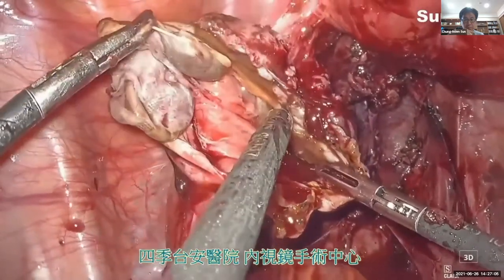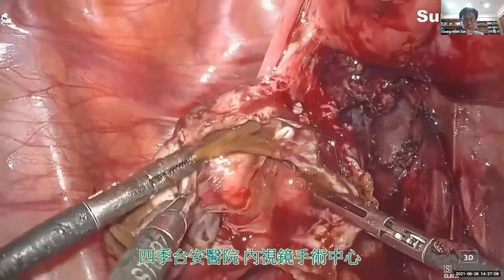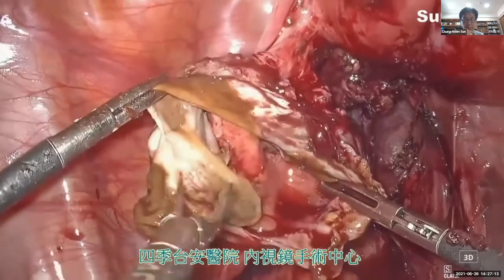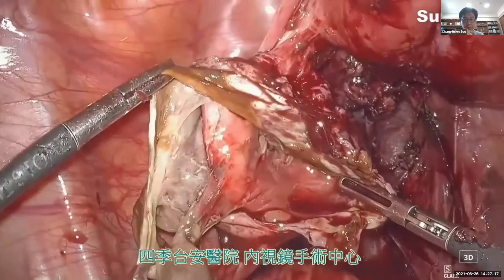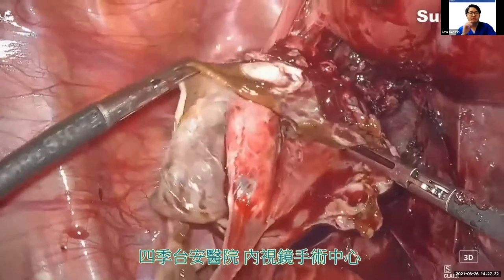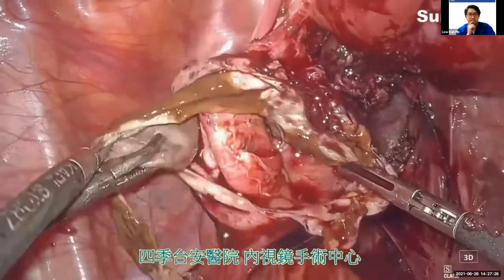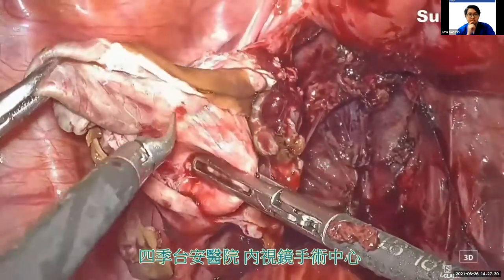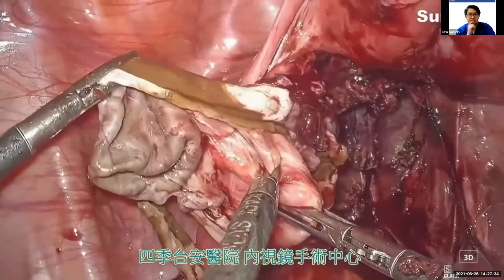Now we can see another small endometrioma here. Again, stay close to the cyst wall.